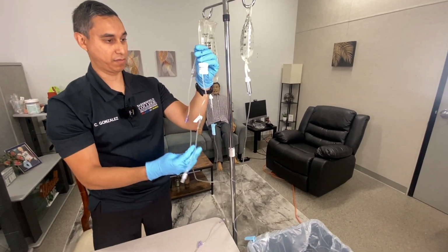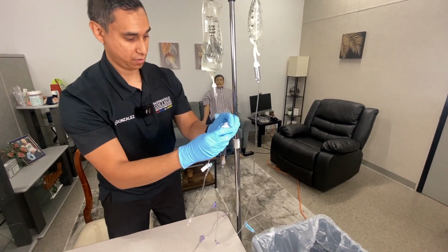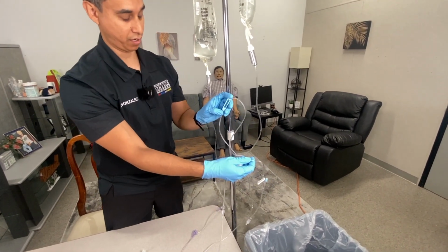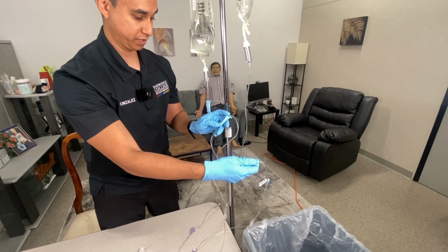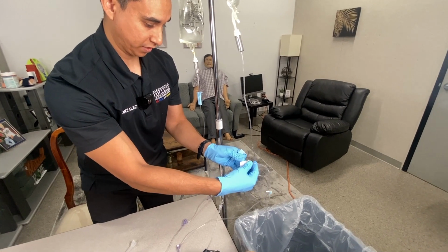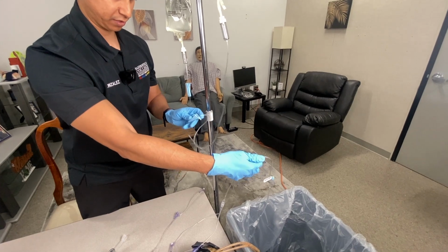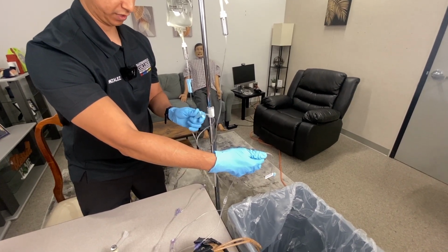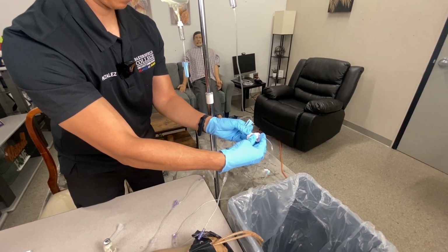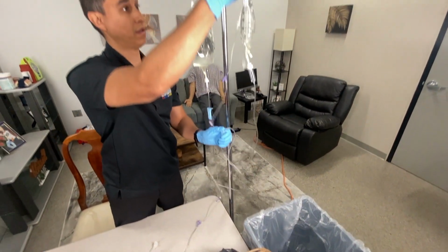Now, I already connected my dial-a-flow to my tubing. Make sure that it is in the off position, and make sure that my clamp is clamped. I'm going to now open my clamp and open the dial-a-flow to run fluid throughout the tubing, which it is. Now I'm going to clamp and turn off my dial-a-flow. So I have my medications ready.